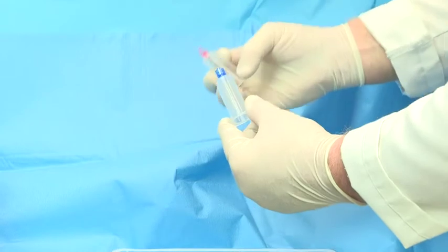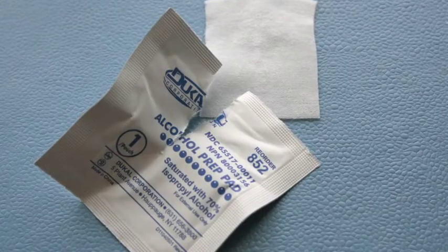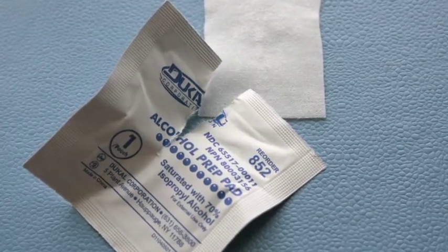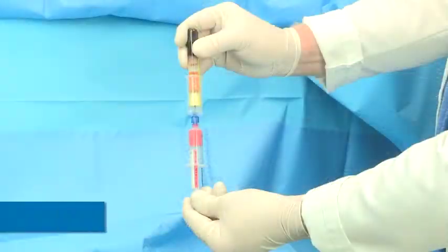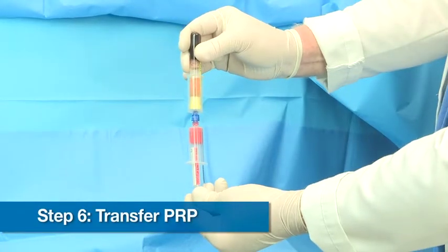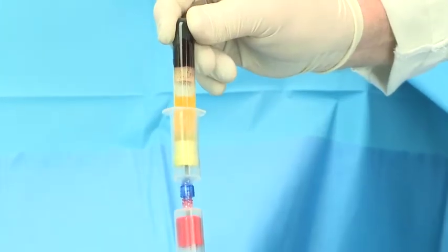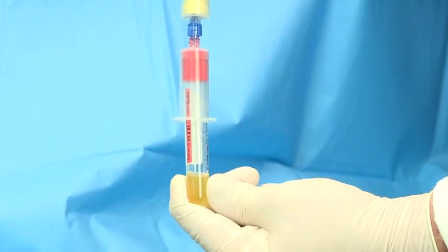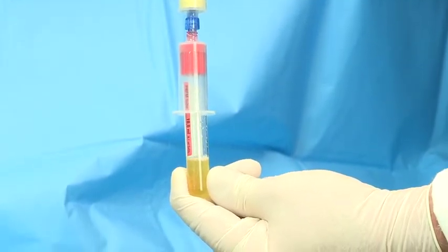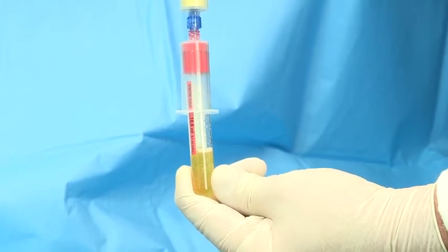Assemble transfer device by pushing the ends together using a twisting motion until secure. Wipe tops of yellow PRP tubes and red Prfm tubes with clean alcohol swab. Hold transfer device vertically. Puncture yellow PRP tube and red Prfm tube at the same time and hold until PRP is transferred. Remove the PRP tube and transfer device from Prfm tube.